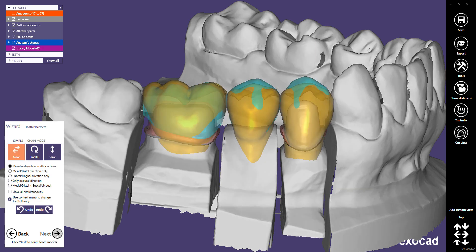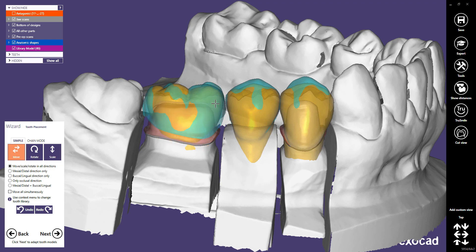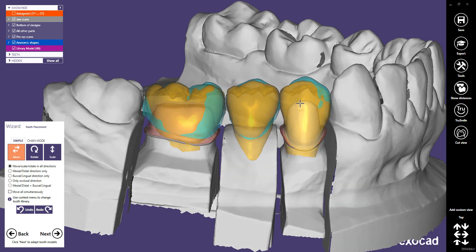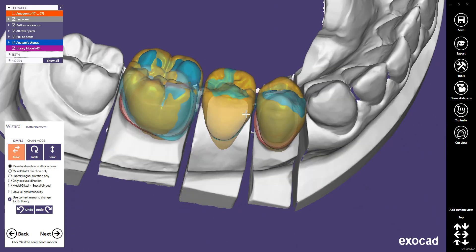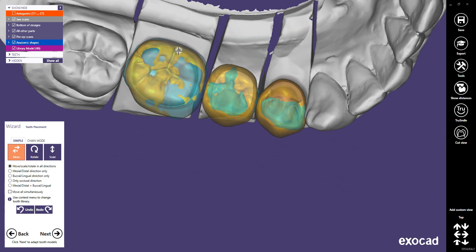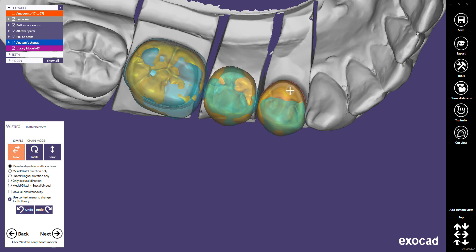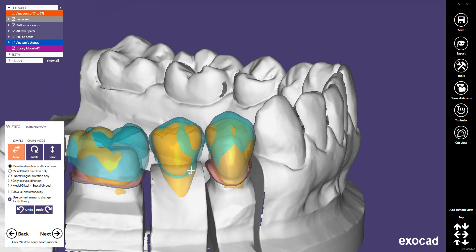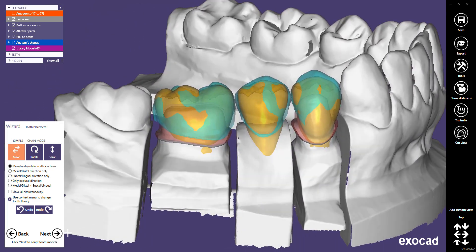The light blue color of the cloned teeth tells you they will be used as a pre-op scan model. A pre-op scan is an additional scan that helps you create your design, while the actual construction is performed the classic way by loading tooth models. Adjust the tooth placement so that the model teeth are close to the pre-op model for better results when adapting the model teeth to the pre-op scan.